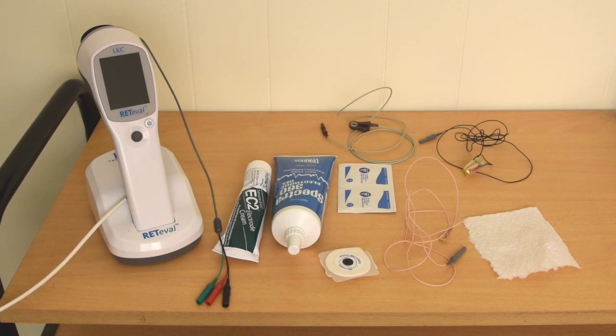The flash VEP test is different from the other tests usually performed with the Radeval device. For this test, instead of sensor strip or corneal electrodes, you will be using a gold cup electrode along with electrode paste. You will also need reference and ground electrodes in the form of a forehead patch and ear clip respectively.